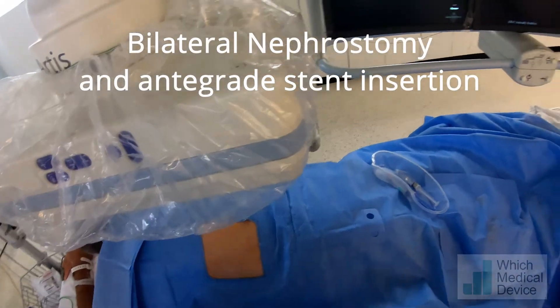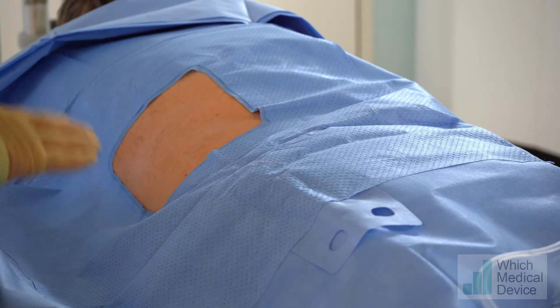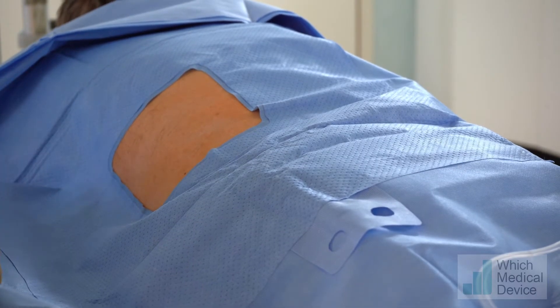This gentleman is anuric with bilateral hydronephrosis and obstruction due to a mass in the bladder. We're not quite sure what the underlying pathology is, so what we're going to do today is bilateral nephrostomies and attempt antegrade ureteric stents to bypass the obstruction.